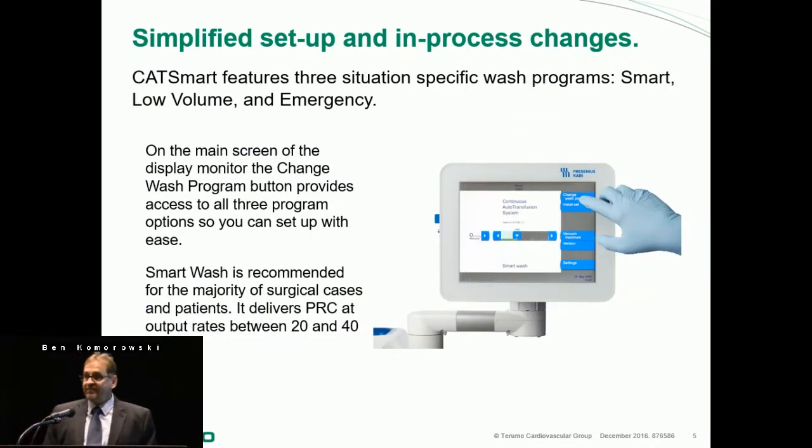There's a new touch screen. Everything on the CatSmart that is blue is a touch point, so it's ergonomically designed, and those touch points extend to the screen as well. Everything on the screen that is blue is a button that you can use to change something on the screen.